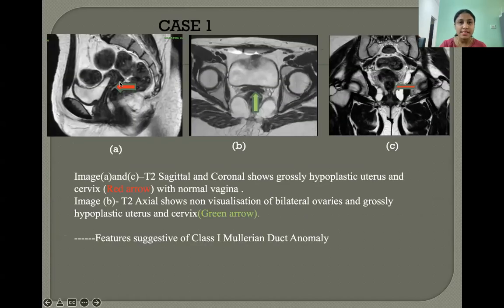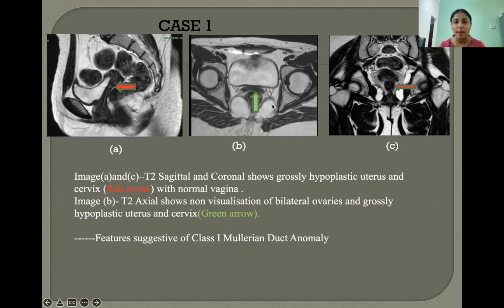Case 1: Image A is T2 sagittal and image C is T2 coronal, showing a grossly hypoplastic uterus and cervix with normal vagina. Image B is T2 axial, which shows non-visualization of bilateral ovaries with hypoplastic uterus and cervix. These features are suggestive of class 1 Mullerian duct anomaly.